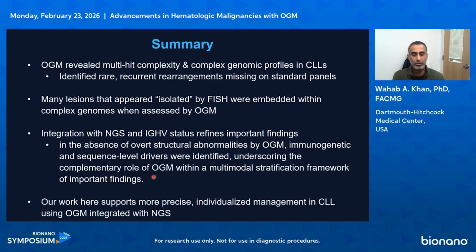So our work here supports overarching, more precise, individualized management, or potential for more individualized management in CLL, integrating OGM with these other multimodal approaches.